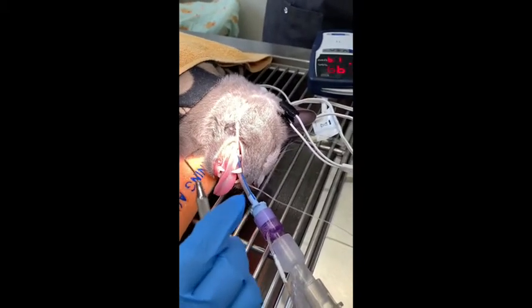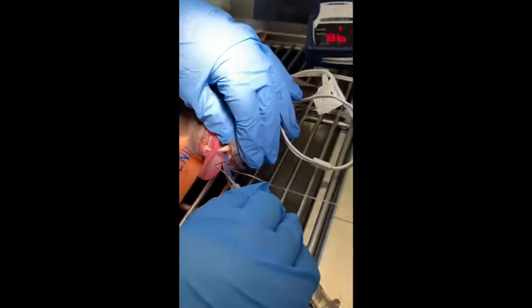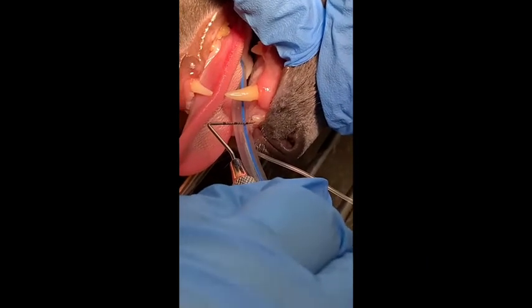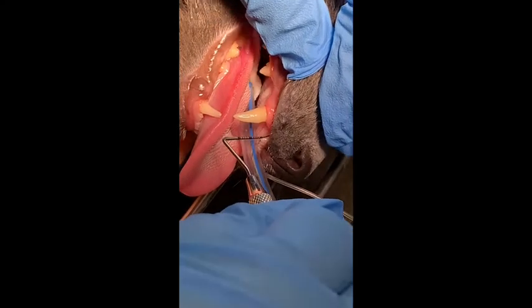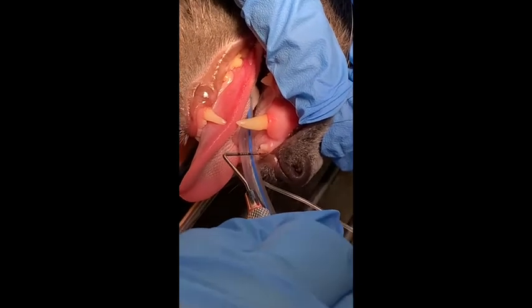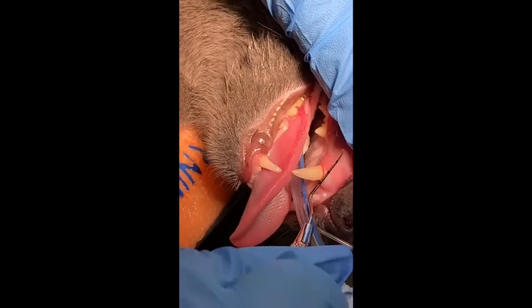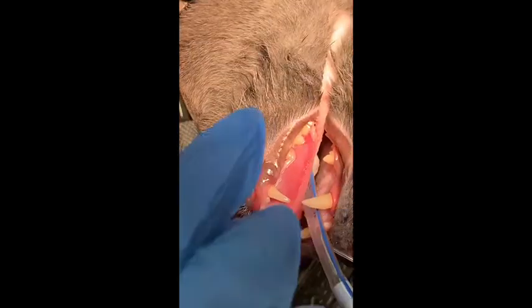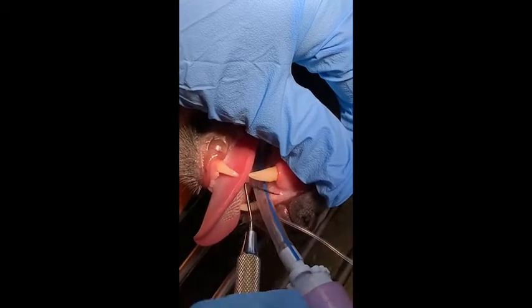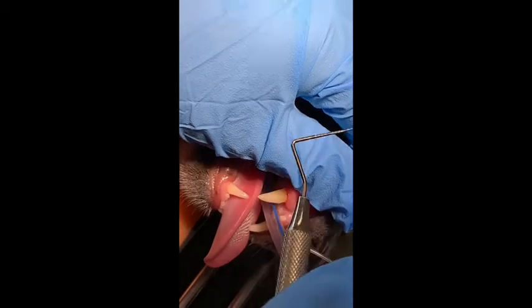We're going to start with the 103, which is the incisor. So the little one here is the incisor 3, and to check that pocket depth, so that is 0.5, going around the whole circumference of the tooth, checking for things like mobility. There's no mobility in that one. There's no recession or anything, so you can't see the bone coming through above the line of the gingiva, and there's no gingivitis, so that one's really good.